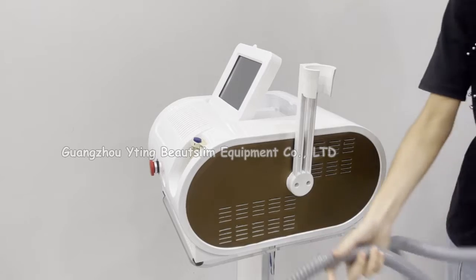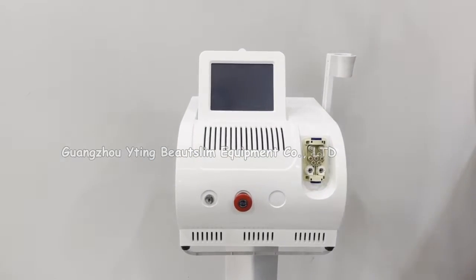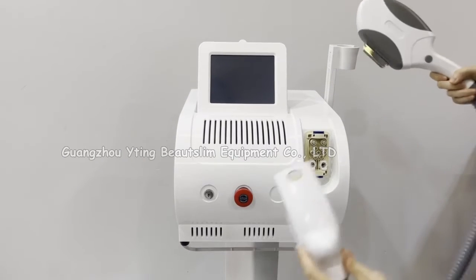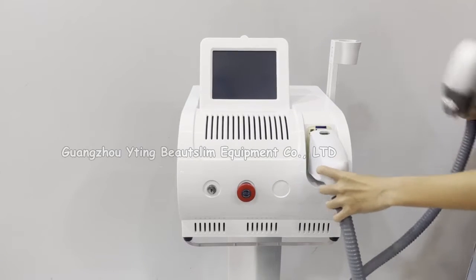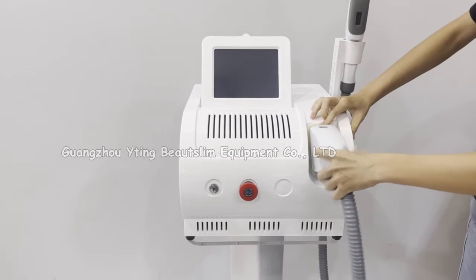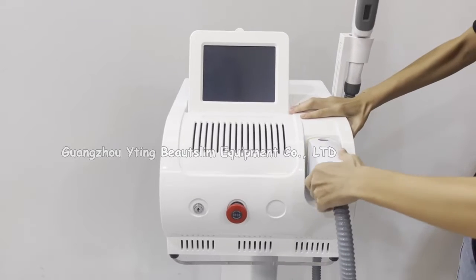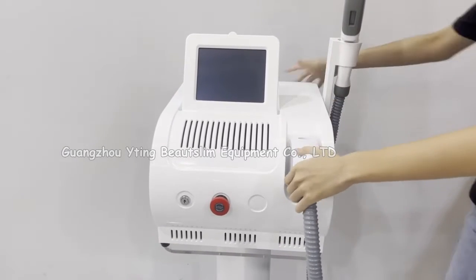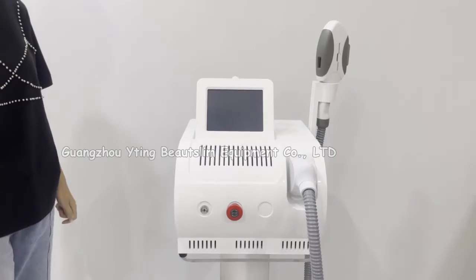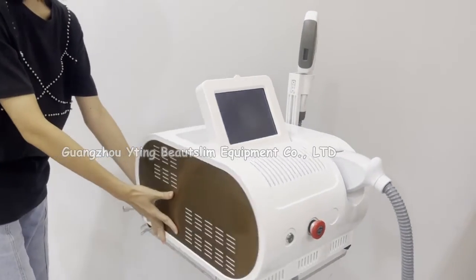Connect the handle to one piece. After connecting the handle, you need to add water to the machine.